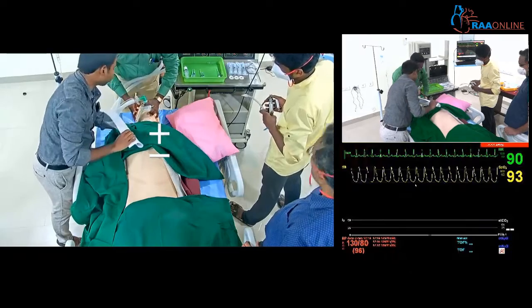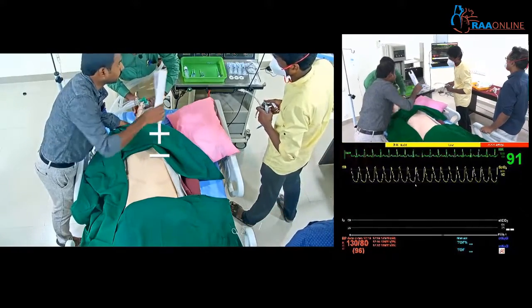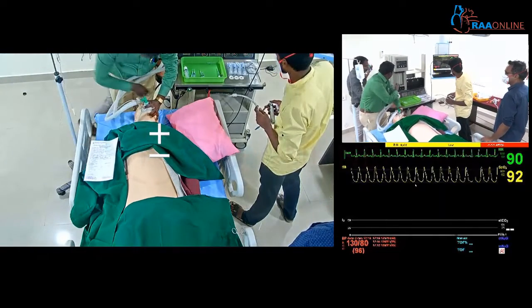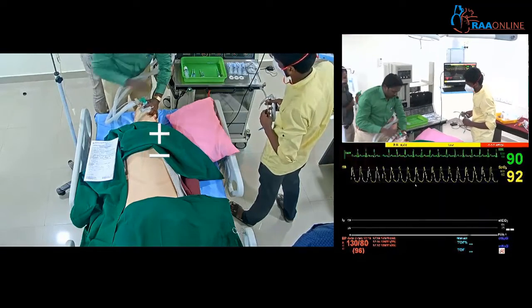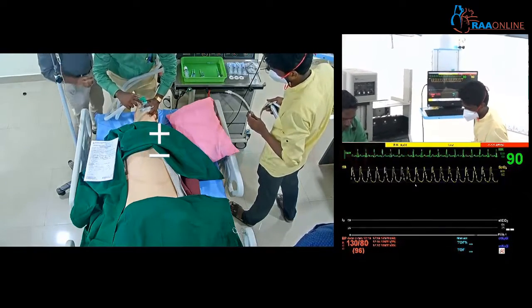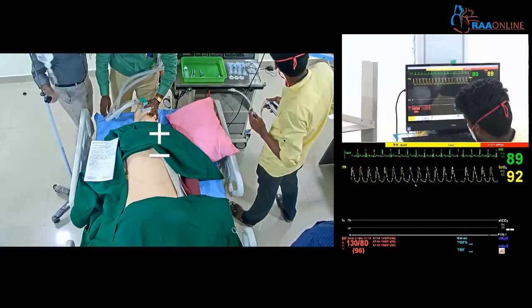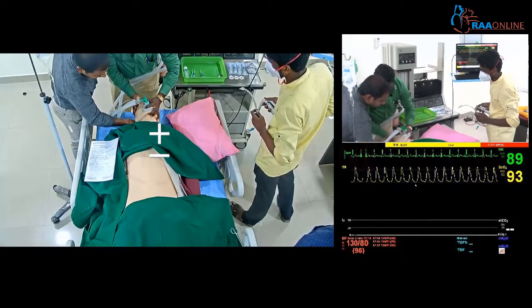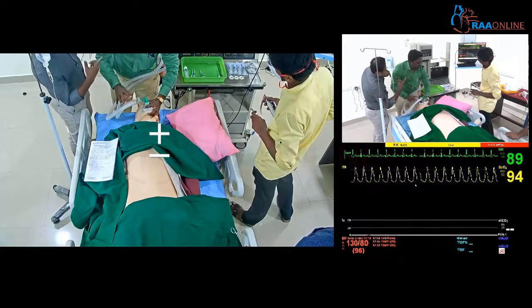Is there neck flexion? No. See, the patient is desaturating because we are not ventilating the patient. Are you able to ventilate the patient or not? Yes, sir. Able to ventilate the patient. So first you have tried positioning, we assume that we had kept a proper positioning like neck flexion. Okay, sir. Still we are able to ventilate, no? Yes, but sir, still the patient.